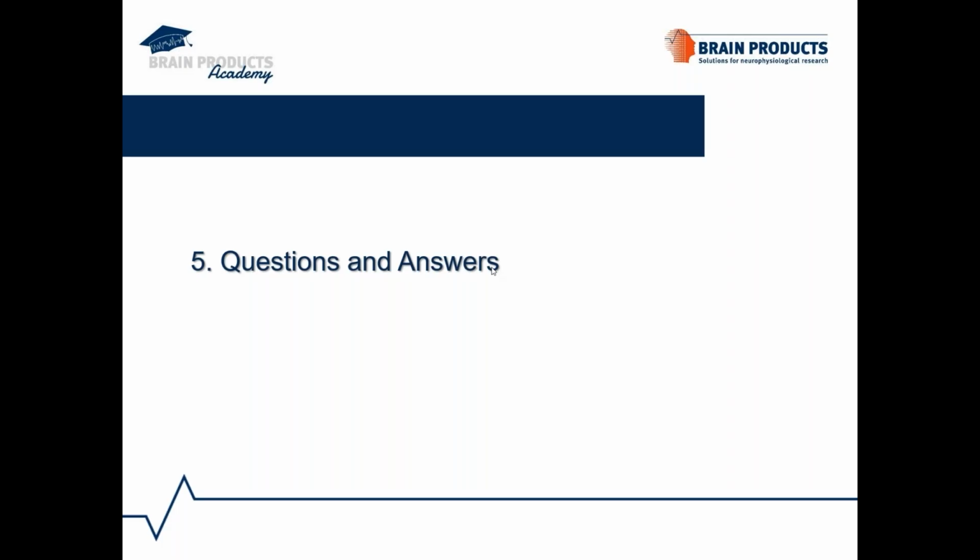I'm wondering how this method differs from FFT, and how can I achieve Welch's method in Analyzer? Thank you, Kidis, for the questions. This is a very good question and very interesting. In fact, FFT and Welch methods are very similar.